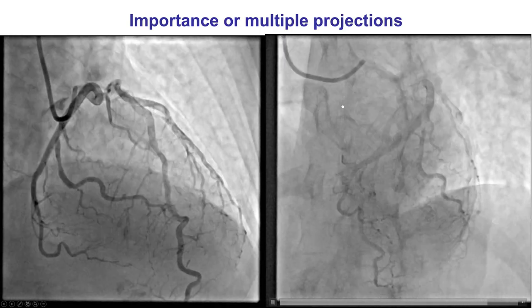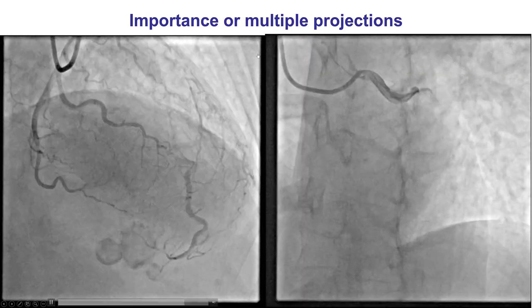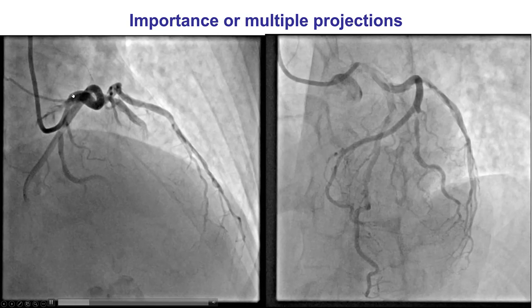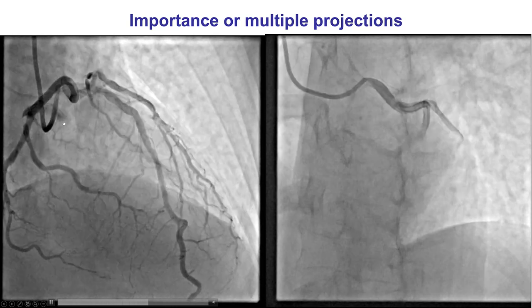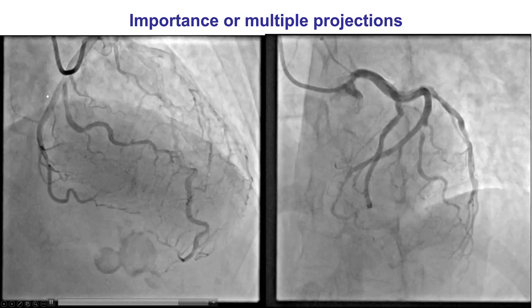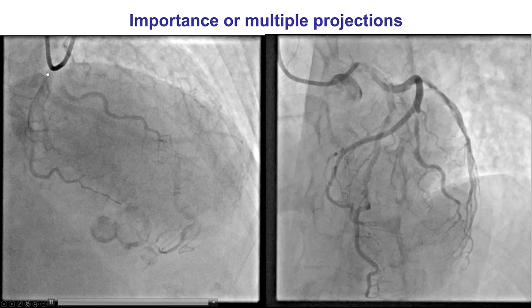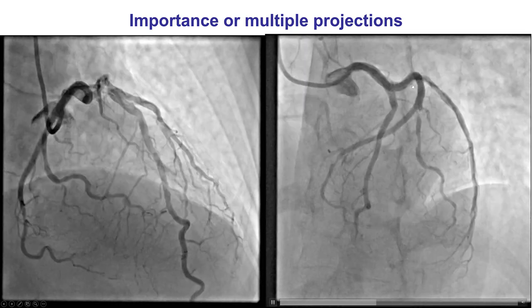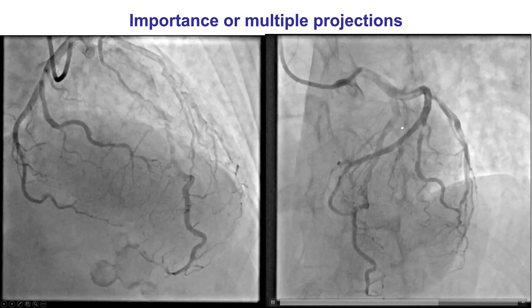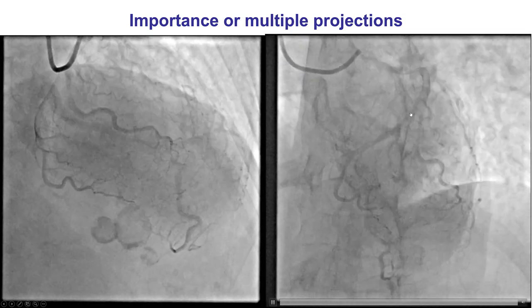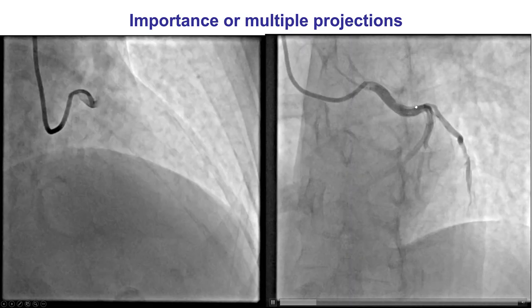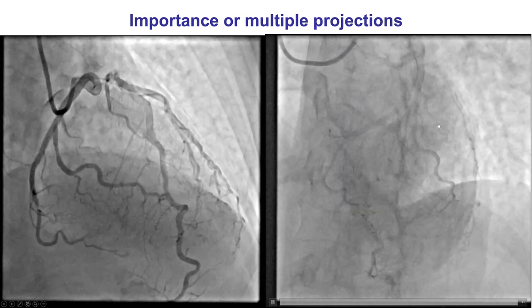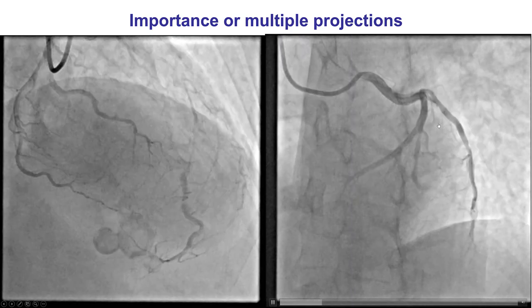In osteal lesions, it is important to do multiple projections. This is an example where the RAO cranial does not really show the lesion of the ostium of the obtuse marginal branch. However, the LAO cranial does nicely demonstrate the ulcerated lesion at the origin of the OM2.